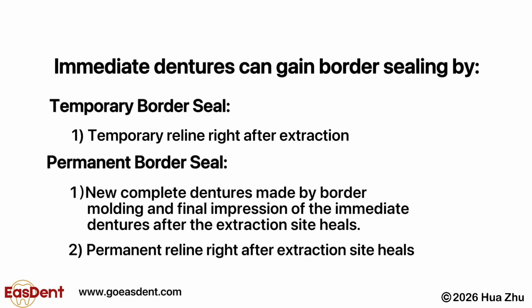Immediate dentures are supported entirely by soft tissue. Therefore, accurate tissue adaptation and a well-sealed functional border are critical for retention. Intraoral scan alone cannot reliably capture the functional border for immediate dentures. However, because immediate dentures are provisional, intraoral scanning may still be used initially. Border sealing can be temporarily established by adding reline material to the denture base following extractions.